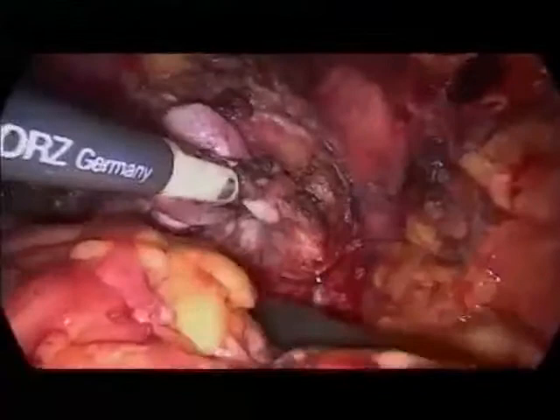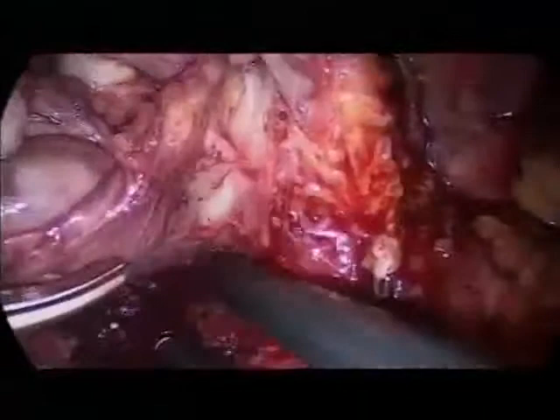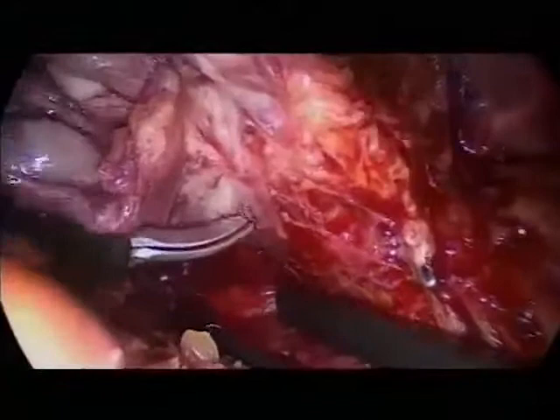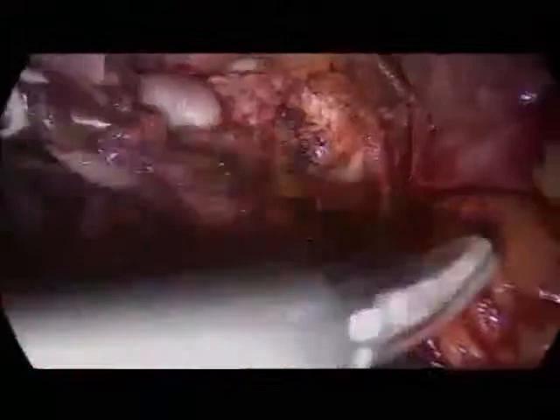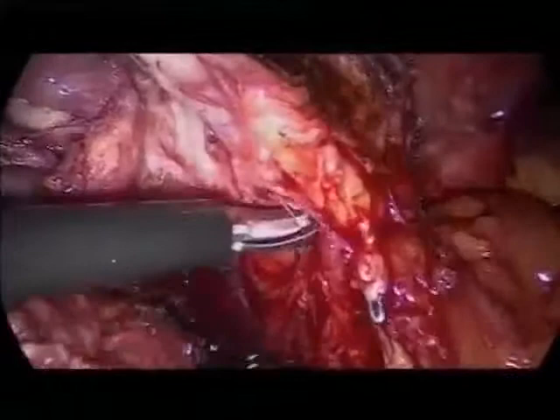And how do you define the height of the incision here on the pedicle? So the closest to the prostate or? Probably this is one advantage of conventional laparoscopy. You can feel the solid structure of the prostate when you touch it here, and you feel the same here. And this is a very mobile structure here. You can see that. It's not the finger, of course. But you have a feeling, you can see, this is a plane where I can easily dissect, and here is a strong structure. This helps you.